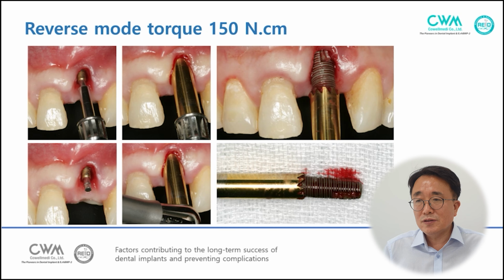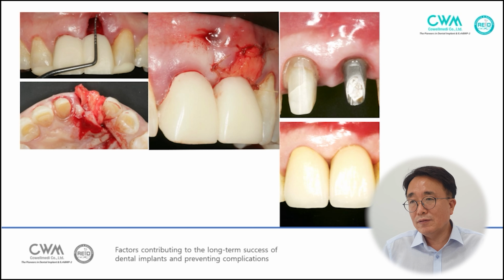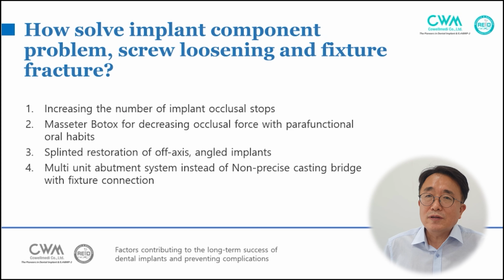And so this instrument, with counterclockwise high torque, could remove the implant in the maxilla, and then a connective pedicle flap was inserted. This case is Dr. Park's case. How do we solve implant component problems?